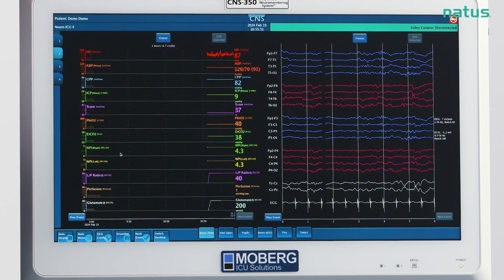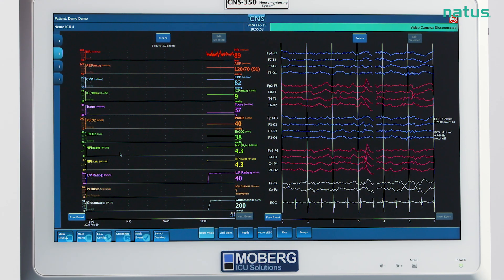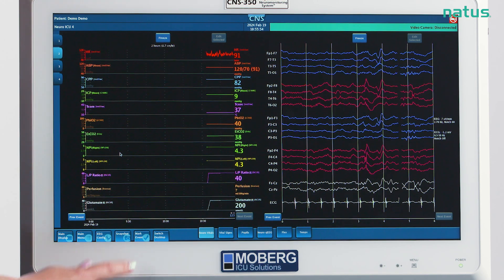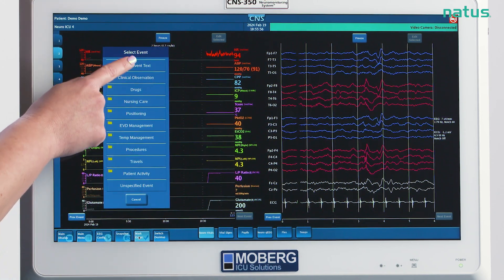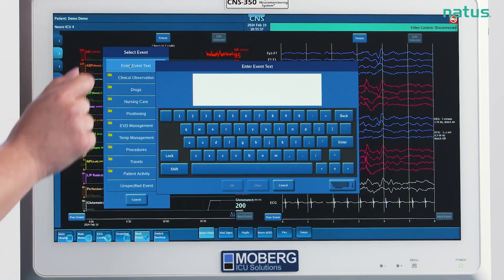To enter an event that is not on the list, you can tap enter event text at the top of the events categories list. Then free text your event and hit OK.